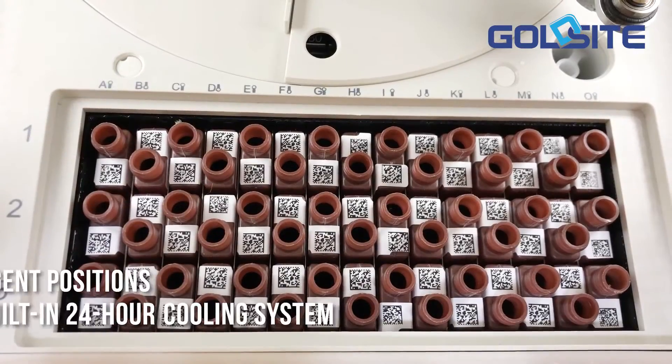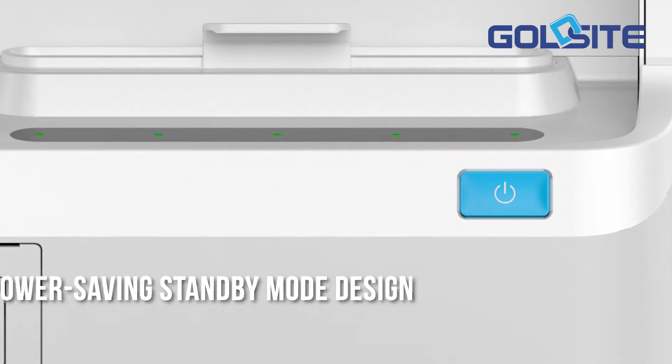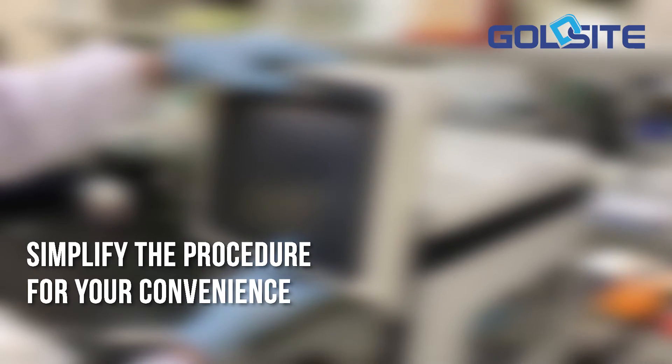45 reagent positions with built-in 24-hour cooling system. Power saving standby mode design allows you to power off the system while the cooling system still works, which simplifies the procedure for convenience.